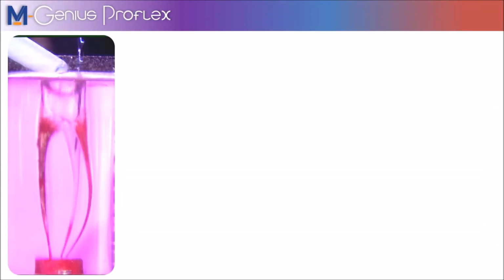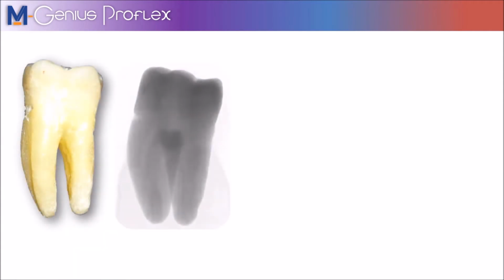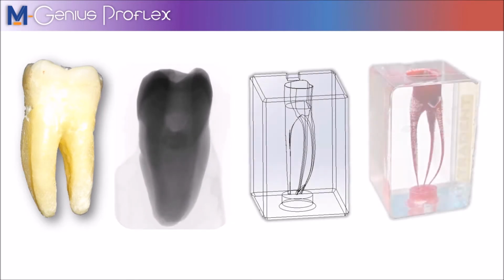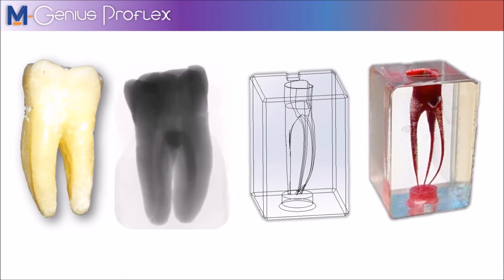To demonstrate the Genius Proflex instrumentation sequence, a training block was developed, printed on a high-definition 3D printer. After a laborious job of detecting the mandibular molar morphology through micro-CT and transferring it to a CAD/CAM model, we were able to reproduce in one clear block the three most frequent types of root canal morphologies. The technique will be demonstrated with Medidenta's Genius Proflex instruments.